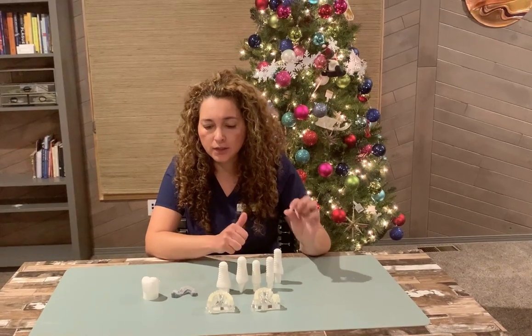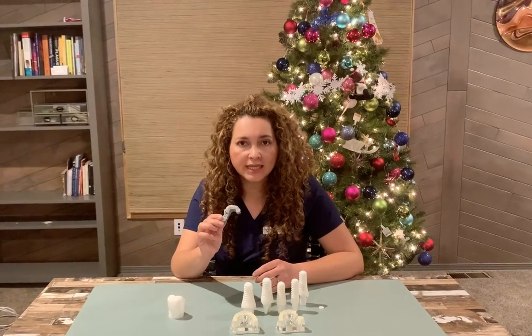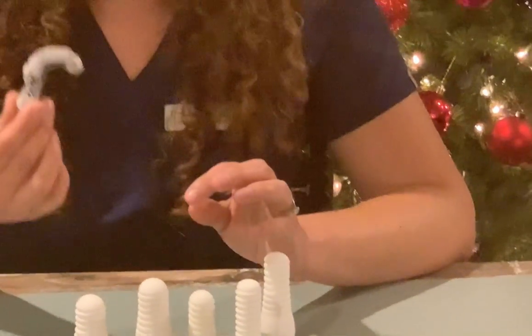Then, when you find out that it's good, we're going to take some digital impressions with our Seren machine to fabricate a surgical guide. This is going to help us in the surgery to be more precise and more accurate with the drilling.